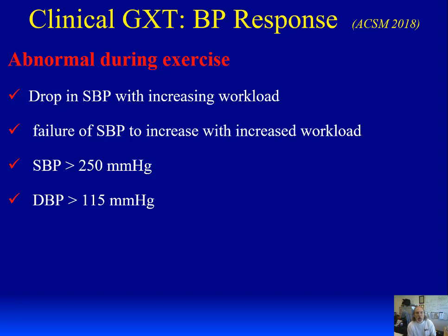If blood pressure doesn't increase with the workload, again, it's a problem. What you're thinking, you're not thinking it, but they're starting to wonder if the person has an aortic aneurysm, or if there's an excessive blood pressure response, i.e. systolic over 250 or diastolic rises over 115.